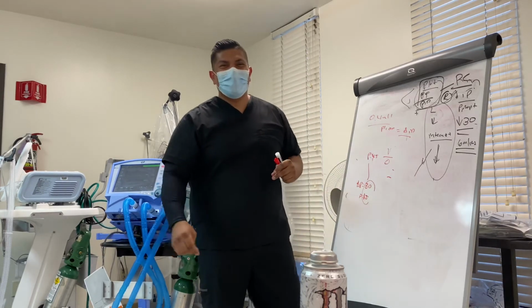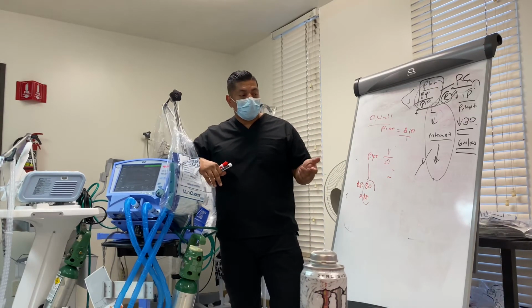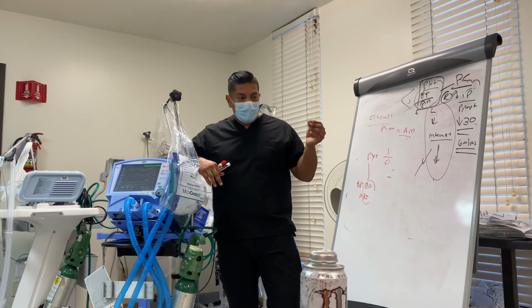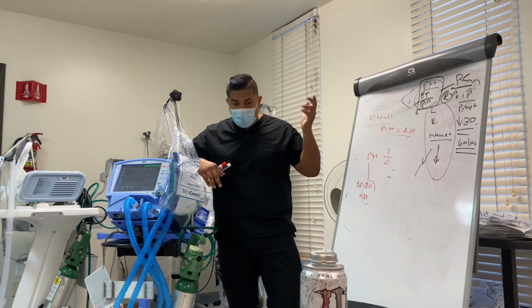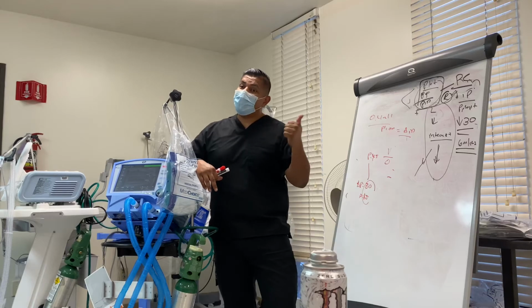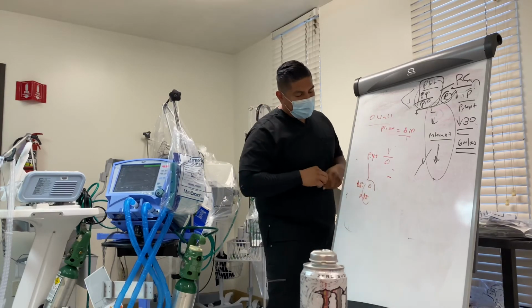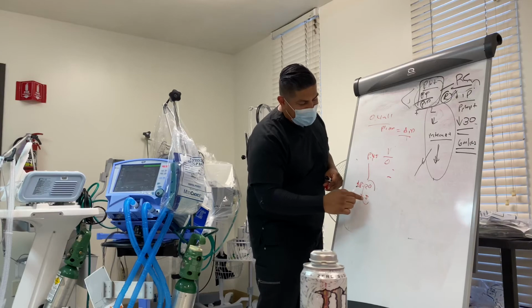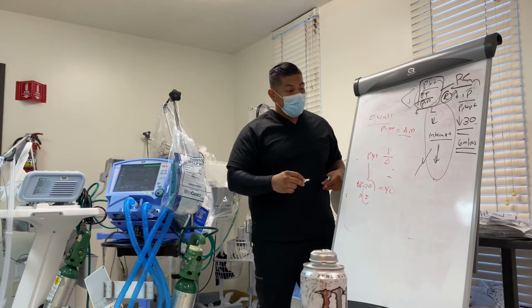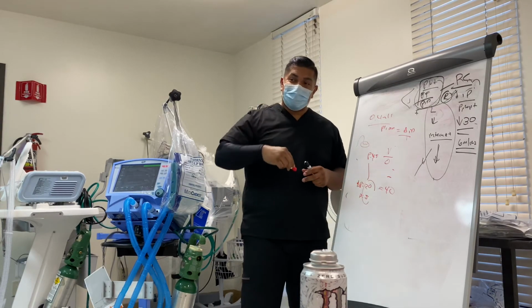I'm kidding, no. But I guess the biggest question that I receive, especially from students, is how do you know if your tidal volume is correct on volume AC? Well, you want to do ideal body weight, and you look at your CO2. If my inspiratory pressure is 20 and my PEEP is 5 and my CO2 is 40, I ain't touching nothing. Leave it alone. And I still have that little pause there. Oxygenation is great. Guess what? I'm going to be working on decreasing my FiO2, right?